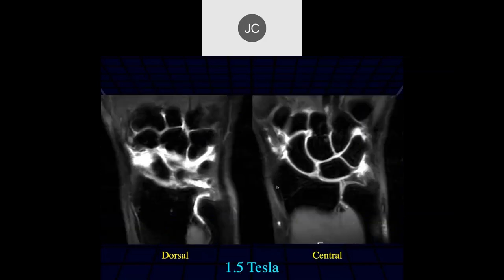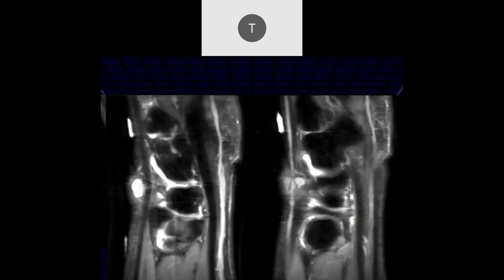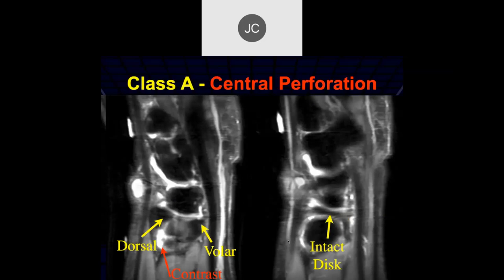Taysen: image on the right, I see a full thickness defect centrally, and then we see some fluid in the DRUJ. Dorsally we see it's intact, and there was a little central perforation. On the sagittal images we can see the dorsal and volar aspects — again, another central perforation.